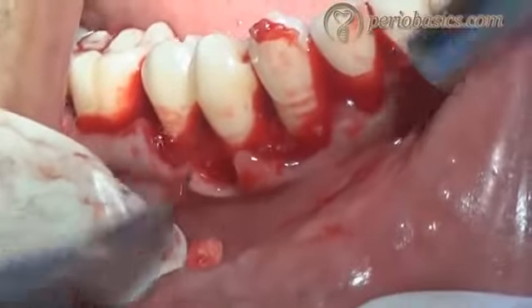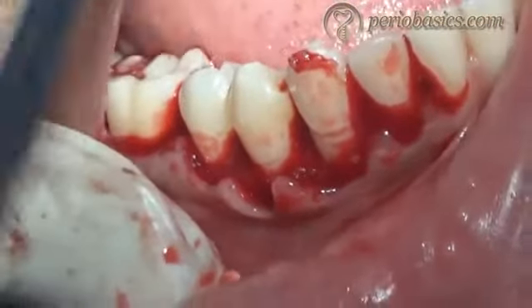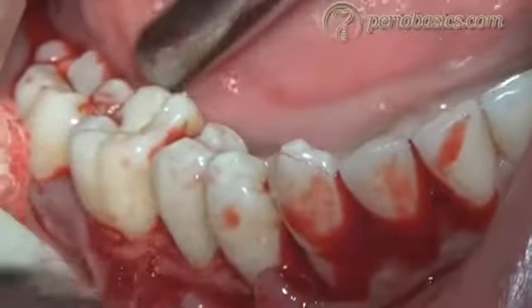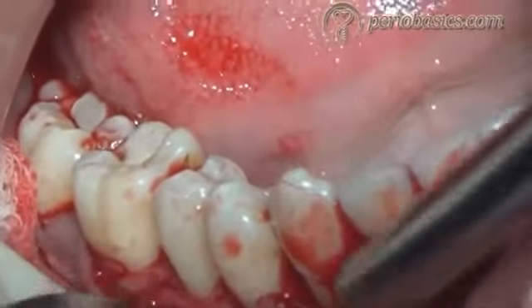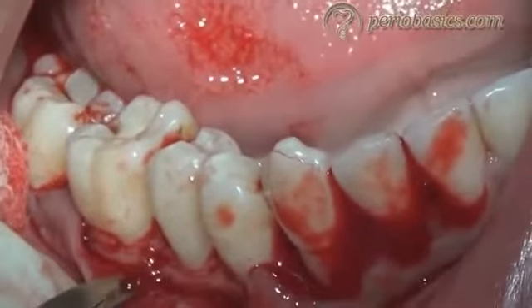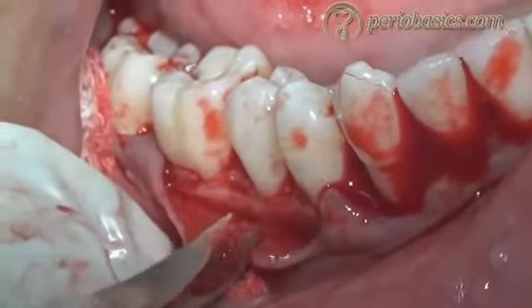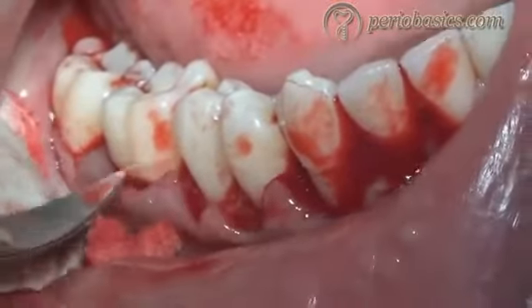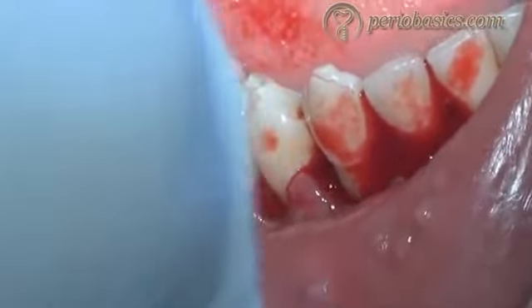The margins of the flap may also be trimmed so that they nicely adapt to the root surfaces. And we have to inspect the bony defect. If there are any bony irregularities or bony protuberances, then we have to do bone reshaping.